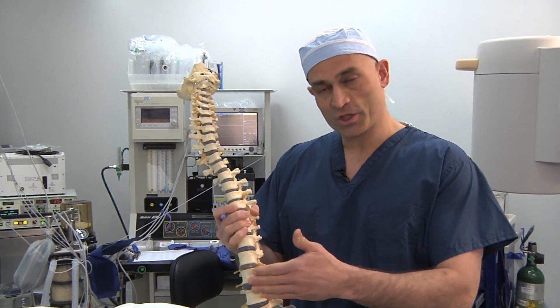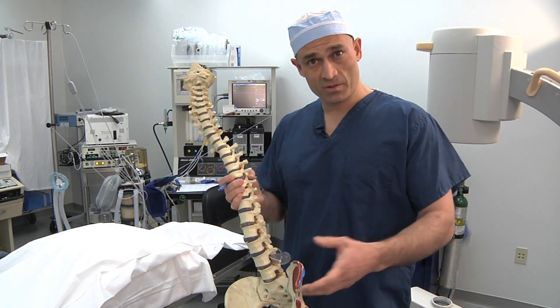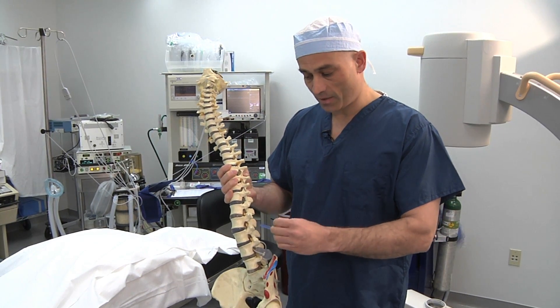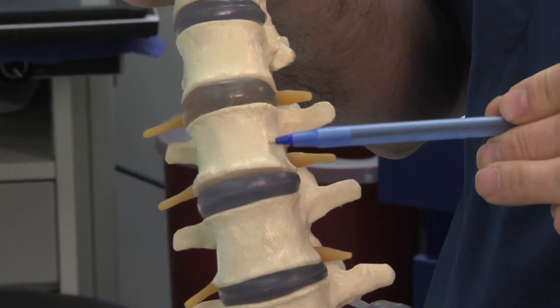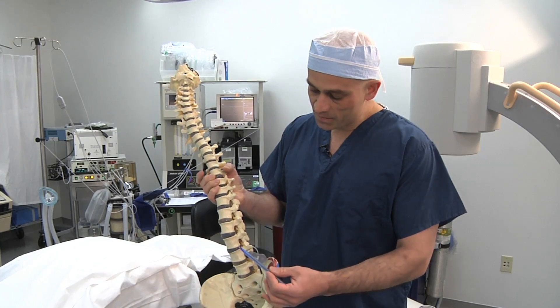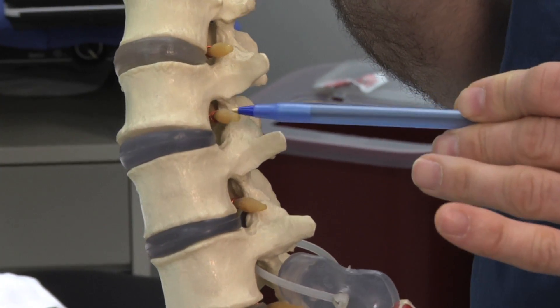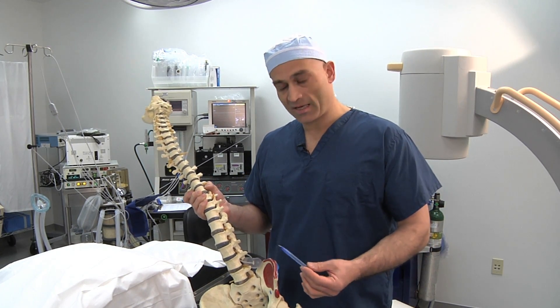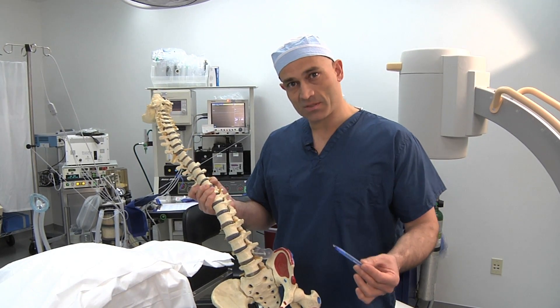To demonstrate the procedure, I'd like to use this plastic model of the spine to show some of the anatomical elements and technical details. This is the front of the spine, and this is the back. These white structures represent the intervertebral bony elements, and the slightly grey structures represent the intervertebral discs. These yellow plastic structures coming out of what we call the neuroforamen represent the nerves — the exiting nerve roots — which supply sensory and motor function to the legs. It's the damage or pinching of these nerves that leads to the symptoms patients can experience.